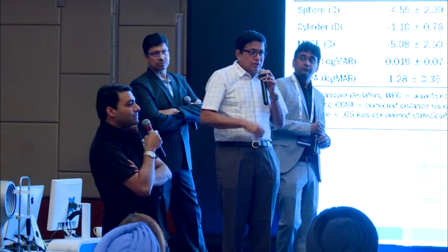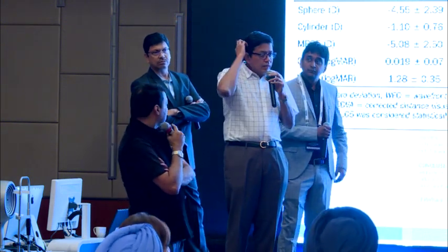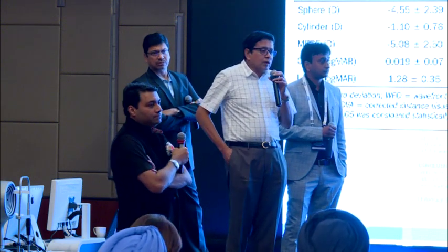And basically, just to answer your question, I think CONTOURA at the end of the day gives you excellent anterior corneal topography, but that doesn't necessarily translate into excellent vision for the patient.